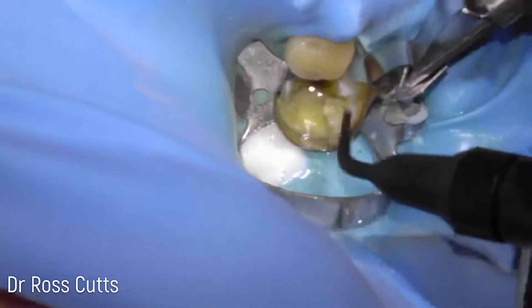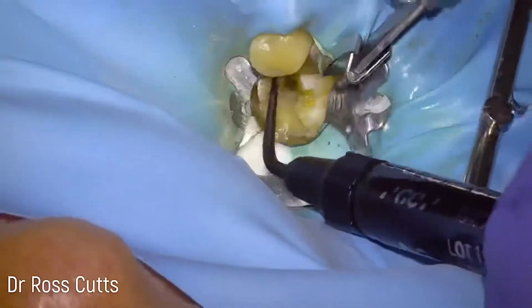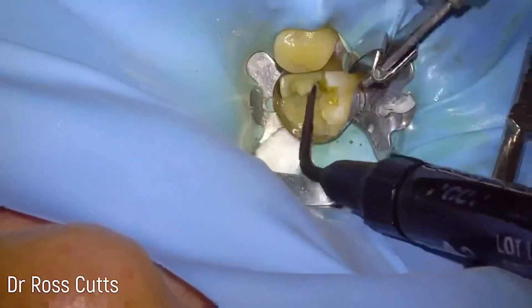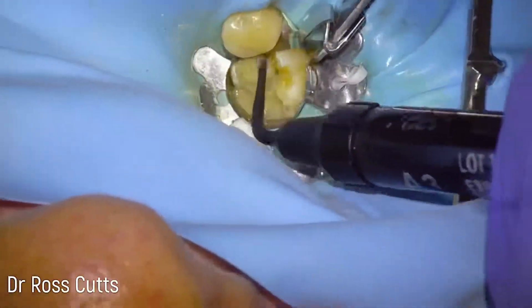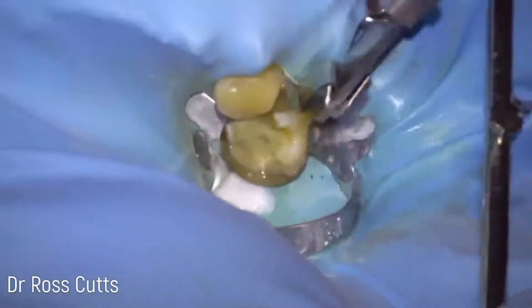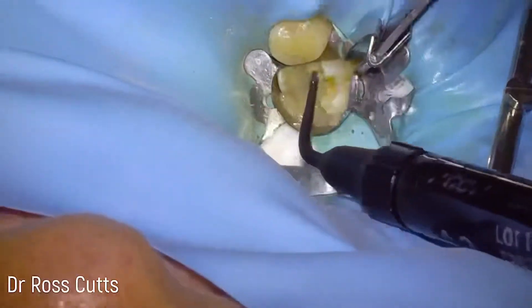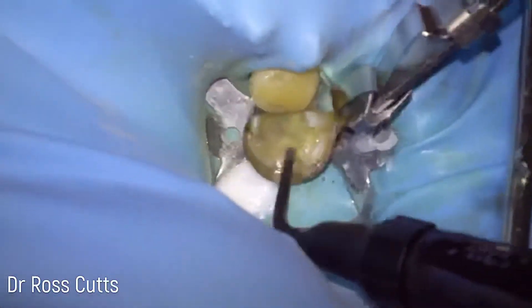Then we apply dentine bonding using a dentine bonding agent and we light cure that. Then we can start the incremental build-up — I like to use a flowable composite resin for the base of the cavity, doing this in incremental layers: a second layer and then a third layer. This is to help reduce dentine hypersensitivity from bonding.